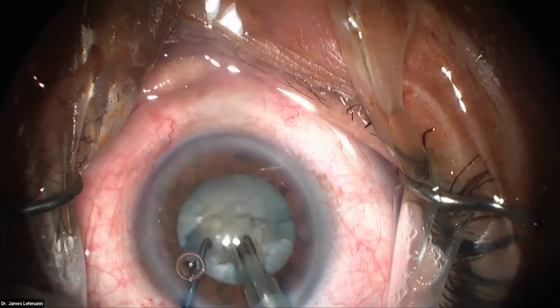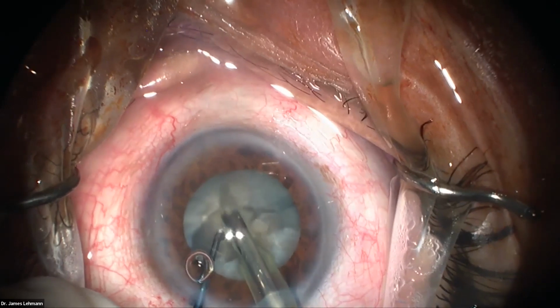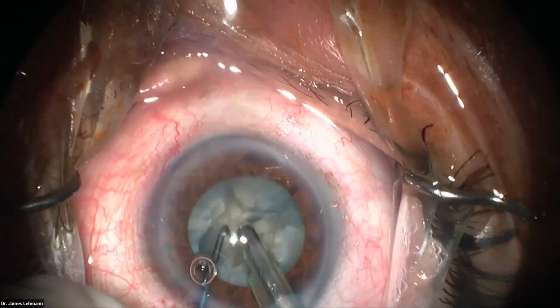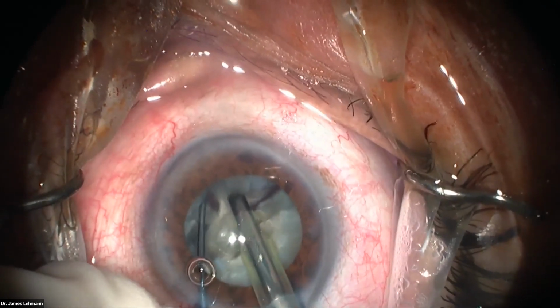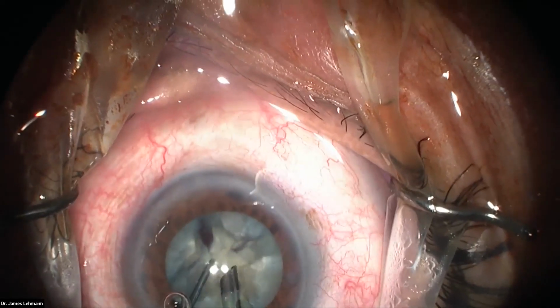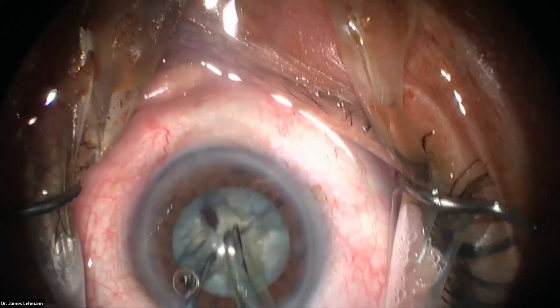Now these are the last hemi-nucleus there. And I'm not taking any of the quadrants out. You can do that if you want. It saves a step, but in a mature cataract, I like to get all four quadrants like that. Now we know we have the quadrants free, but they're kind of locked in like little puzzle pieces. But I know this one here to my left is totally free.